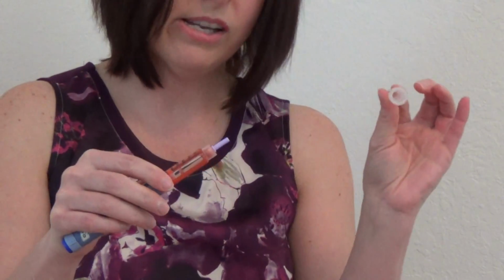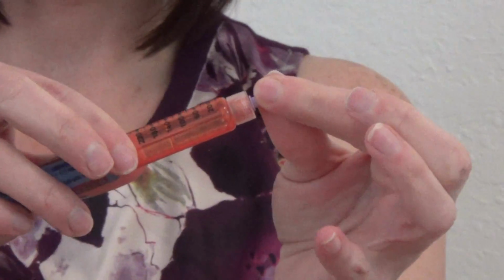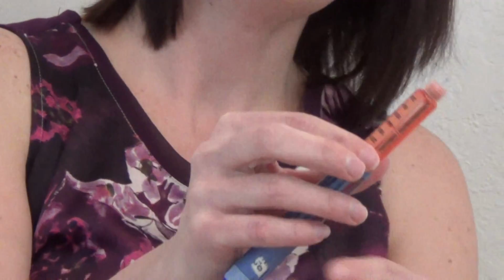You can take off the outer pen needle cap. You want to save this for later. And there's an inner pen needle cap that you take off, and you can throw this away. You want to do a test dose first. You're going to dial it up to 2 units, and then you're going to push in the button and make sure insulin comes out. Once you see this, you're ready to use your pen.